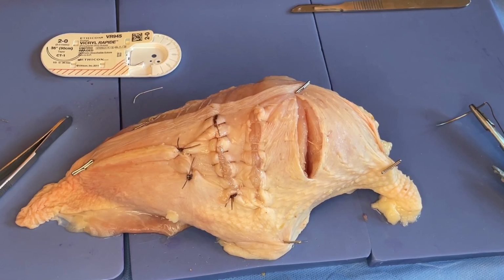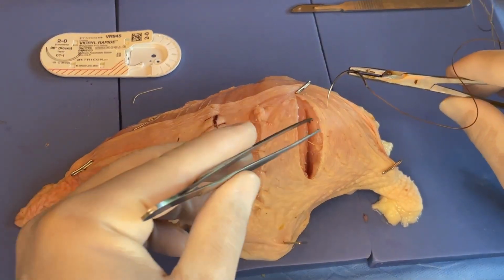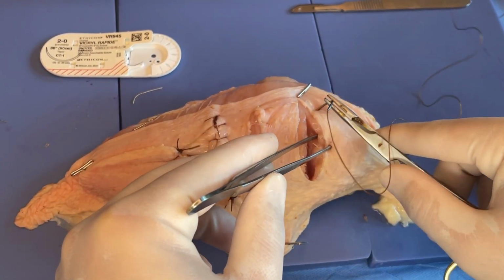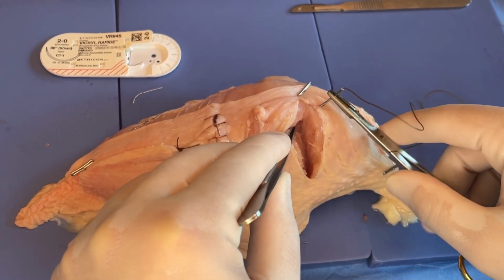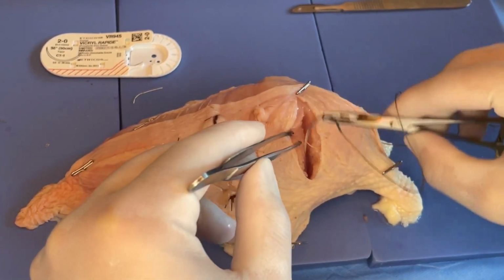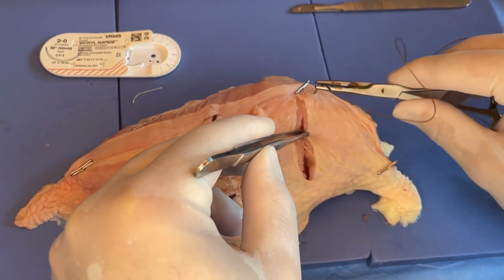All right, let's talk a little bit about horizontal and vertical mattress sutures. We're going to do these as interrupted sutures. To start with the horizontal first, instead of taking a single bite that goes through the tissue so that it's encompassing this divided area here, it's actually a bite that goes parallel to the incision or parallel to the defect, like that. It's a pretty big bite.